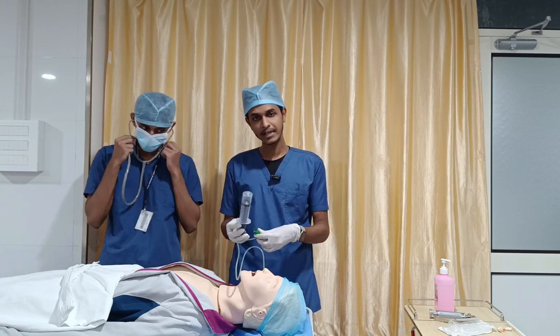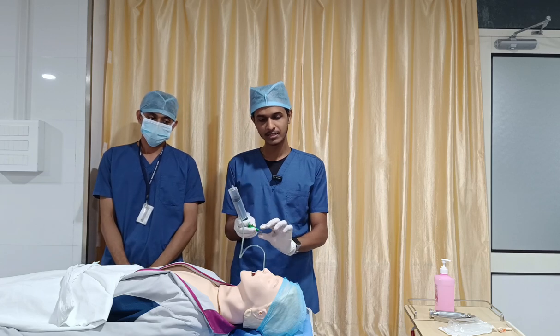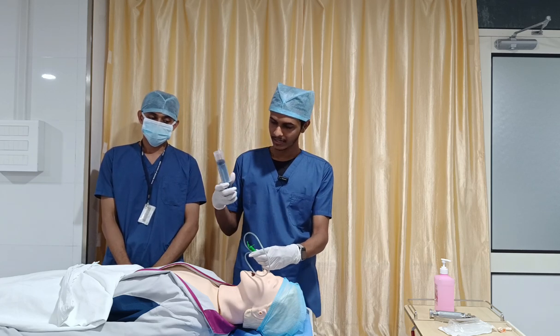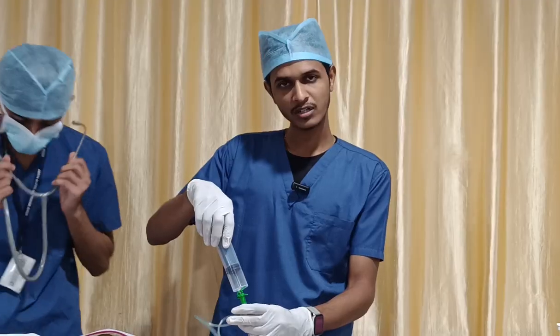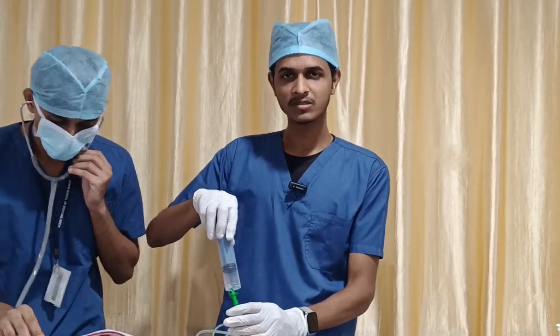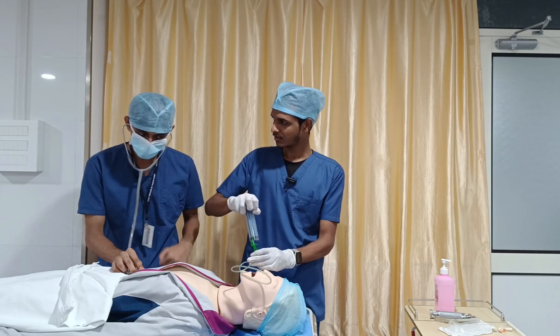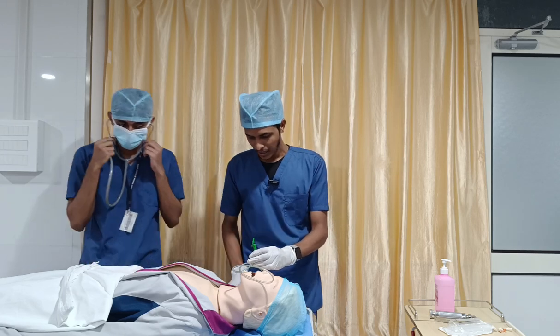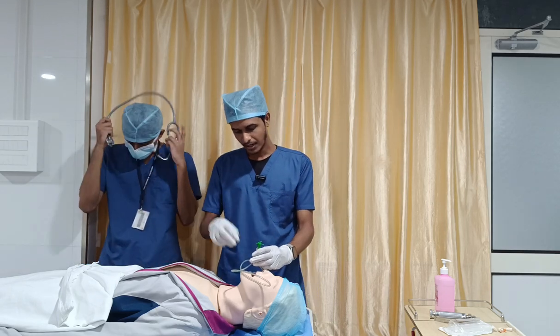So before getting out your syringe, you have to fold the catheter like this. Your catheter should be folded like this, and then again I have to take 20 ml of air. Again, it should not be done in one go, you have to do it at least 2 or 3 times. Okay, so you have to give a thrust. This is one type of confirmation.